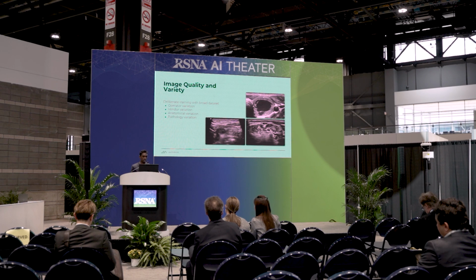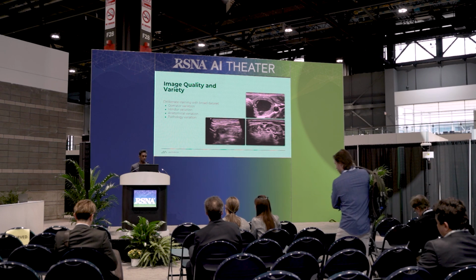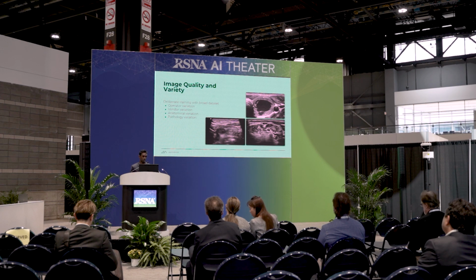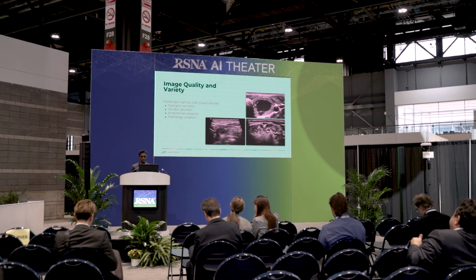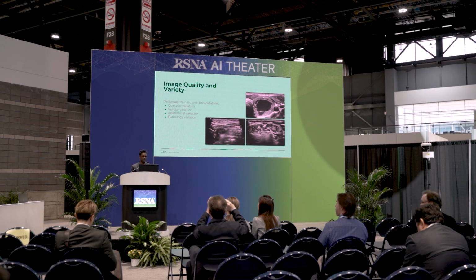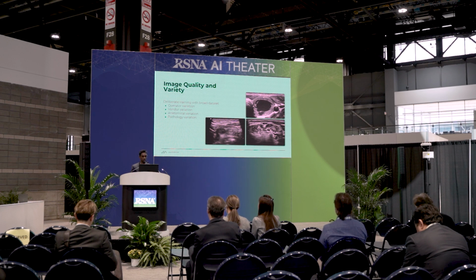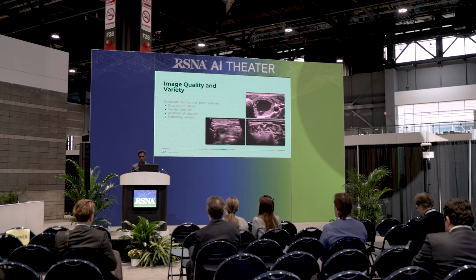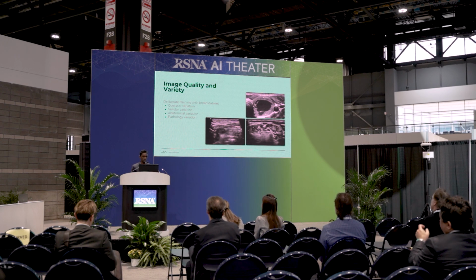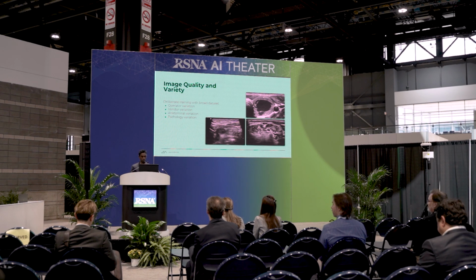One question which often comes up is how the AI deals with scenarios where the image quality is very different across different scans, or there's a large variety. And so what we do here is we ensure that we train our models using as broad and as diverse a data set as possible. And across these 4 dimensions here: operator variation, making sure we have a data set which includes images captured by sonographers with different levels of expertise and across a large number of clinics. Vendor variation, so ensuring that we are supporting all of the major equipment manufacturers. Anatomical variations as well, in terms of the different patient and things like tissue density we see come up quite frequently there. And then finally, pathology variation, so ensuring the data set has a very broad range of pathology from less suspicious lesions all the way to highly suspicious lesions.